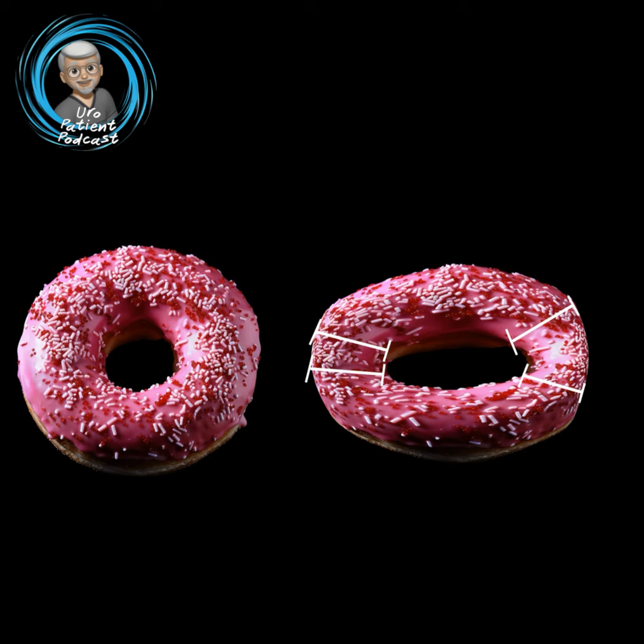Now, sometimes patients will say, well, yeah, it came right out, but I had nothing there. Perfect. That's what we want, is to make sure there's nothing right in the rectum. Because as you can see from the other picture where that probe is showing, it doesn't have to go in very far. And we just want to make sure there's no stool there. That's why we do a bowel prep.